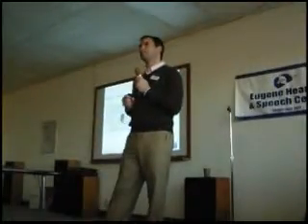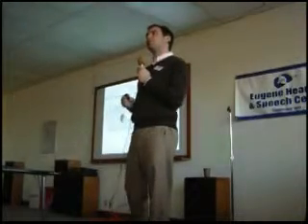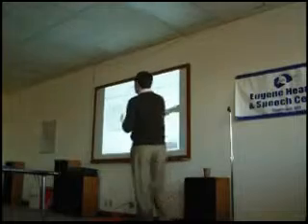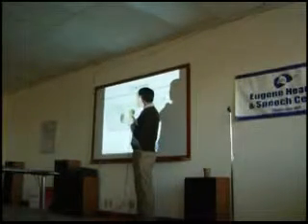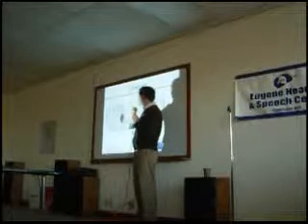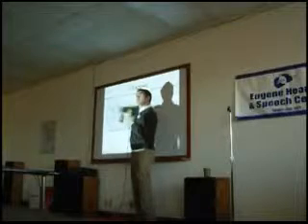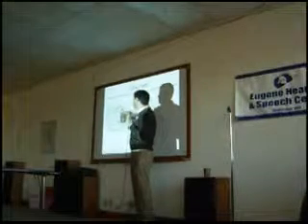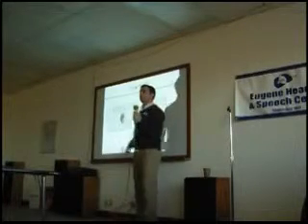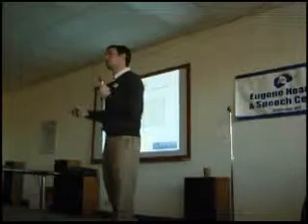If that same sound was broken up into more channels, that same region of sound, all of a sudden, this second sound in this channel, this is the only sound there. So that gets handled accurately. Same here, same here, same here. In these 2 channels, there's still 2 sounds coming in, right? A louder one and a softer one. So the hearing aid is still going to work on this louder one, because that's the one that's going to be more noticeable, potentially more disruptive.